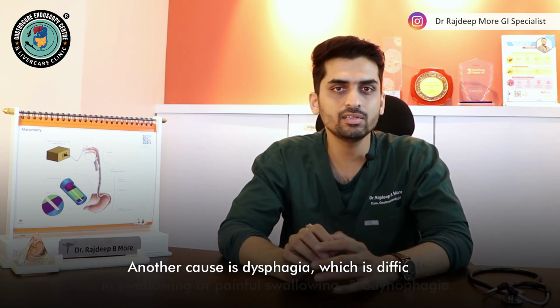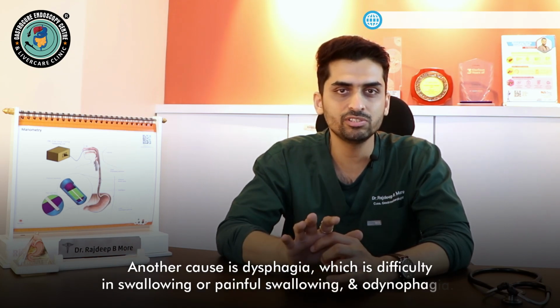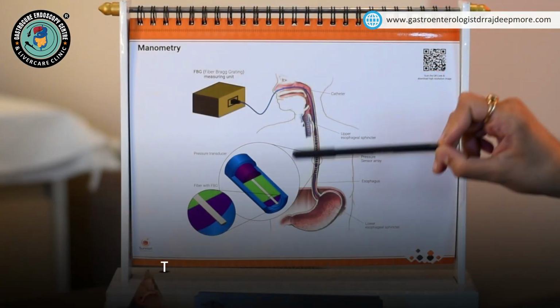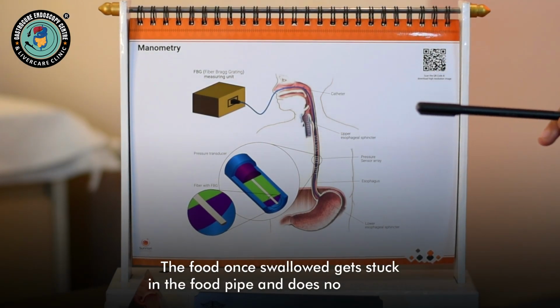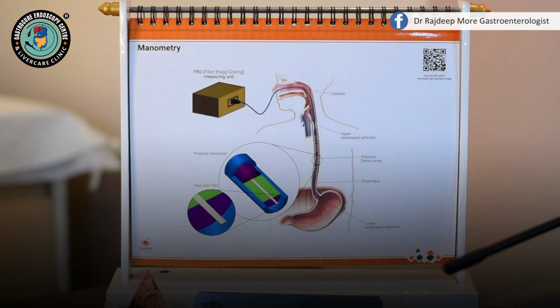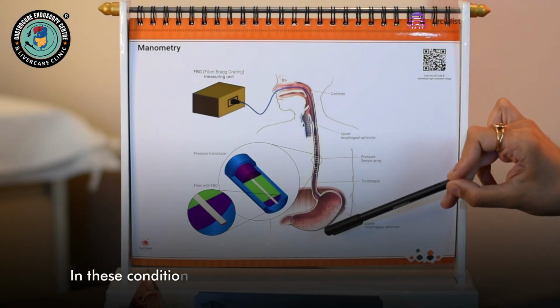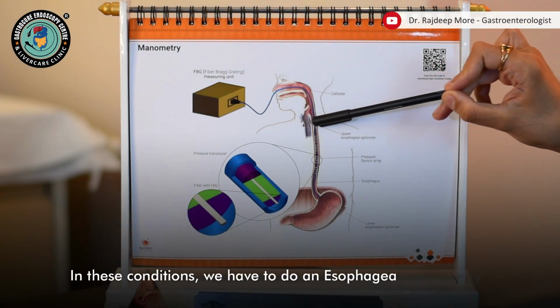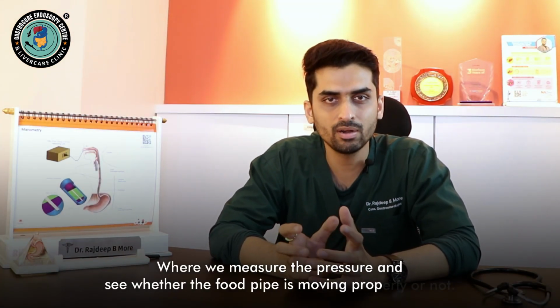And another cause is dysphagia. Now what is dysphagia? That is difficulty in swallowing or painful swallowing, odynophagia, where the food bolus, once it is swallowed, is stuck in the food pipe and it is not going down. So you have done the endoscopy and there is no other reason why it is not going down. In those conditions we have to do an esophageal manometry, where we measure the pressure and we see whether the food pipe is moving properly or not.